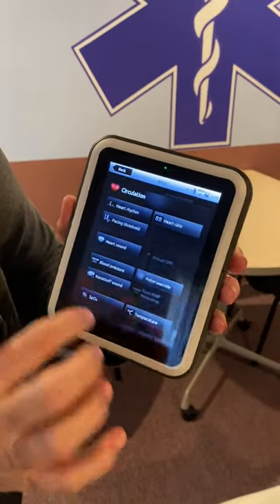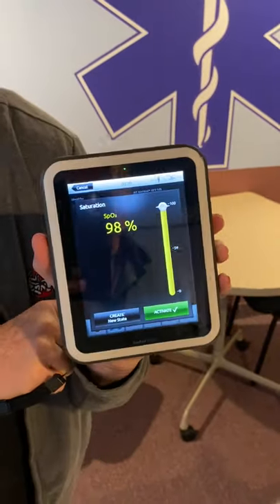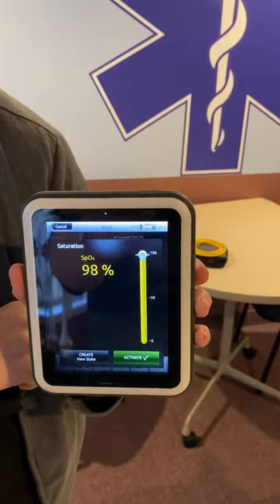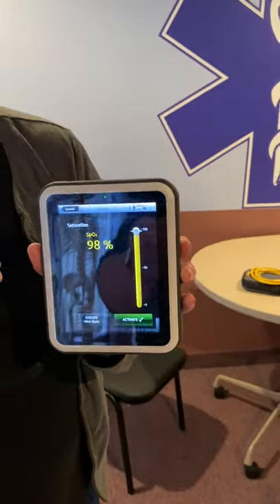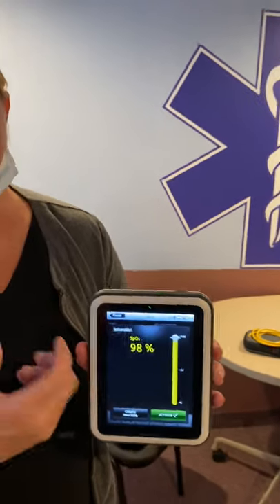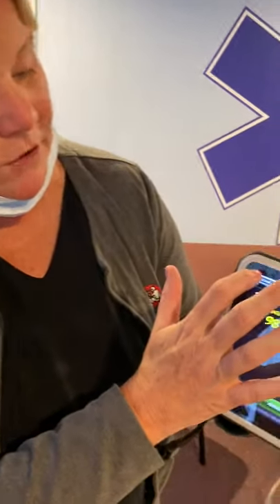Cancel brings you back to the previous screen. Here are your SpO2 settings — you can make those changes, like bring him below 90%. He won't visually react with cyanosis, but you could engage that concept in another way by mentioning the saturations to your learners.